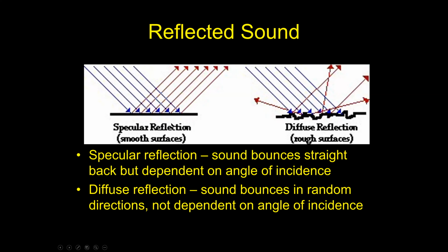On the other hand, if we have a cat that's 14 and has chronic renal disease, he's got very small, misshapen, lumpy, bumpy kidneys. Now we shoot the same blue arrows of sound into it, but we have much less predictable sound waves as they bounce off and reflect off of those irregular edges of the kidney. So we're going to have much less sound that comes back to generate a picture with.